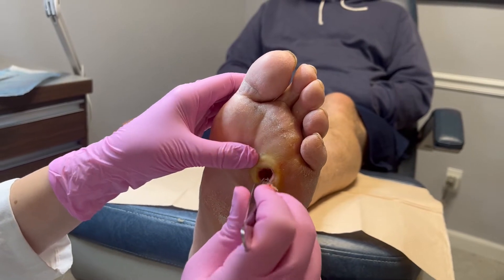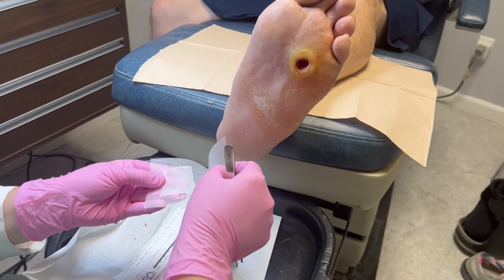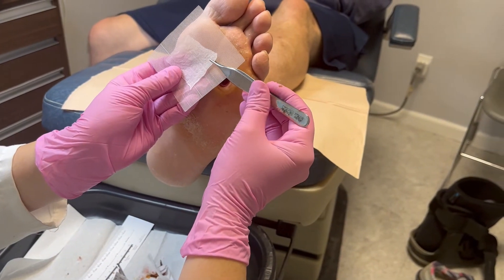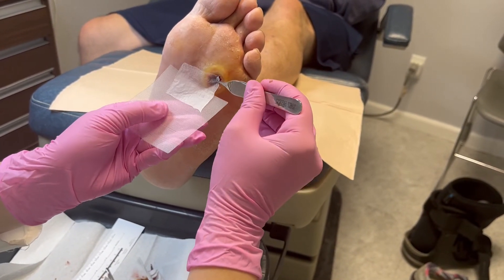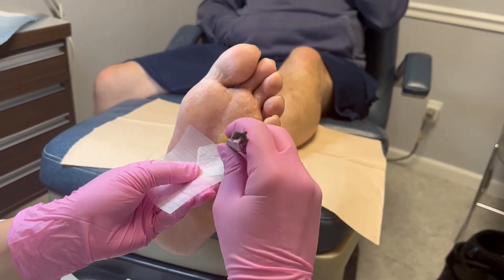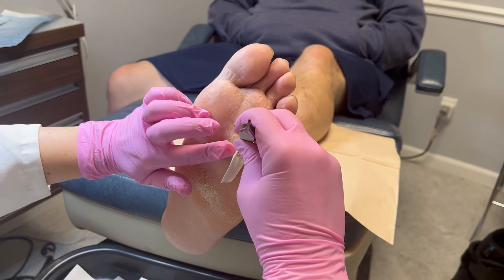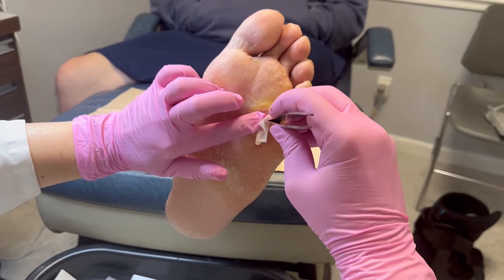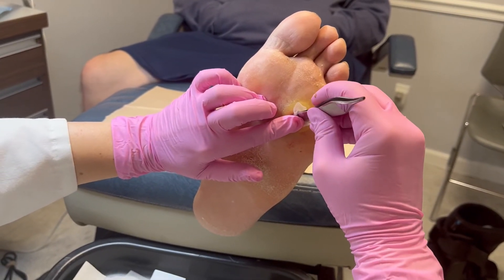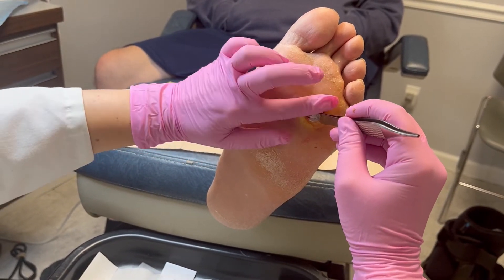We've got a graft here — it's got mesenchymal stem cells from amniotic tissue. I like to get that first corner in, and once I have it nice and flat I feel comfortable rolling it in, just like that, to get those layers. That way I know the whole wound has at least some graft contact and it's not rolling up in a ball.